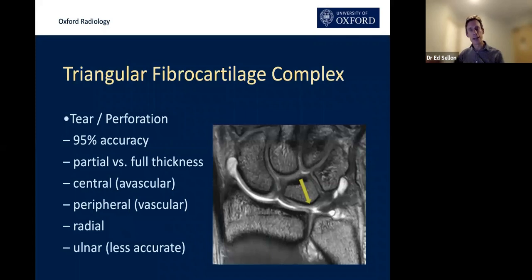This is an example of a large radial-sided tear — look at the free edge of the TFC, which doesn't attach to the bone or the cartilage. There's an associated chondral defect right next to it — you should be looking for those chondral defects. Location is important: is it radial-sided or ulnar-sided, are the ligaments involved? A central TFC tear is pretty easy to spot, but recognising when it involves the ligaments requires an extra level of care. Also beware tiny degenerative central perforations — they're very frequently described and actually quite normal.